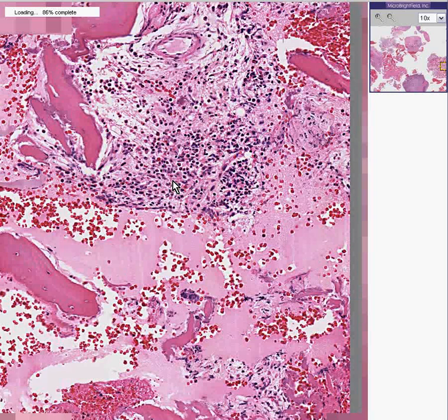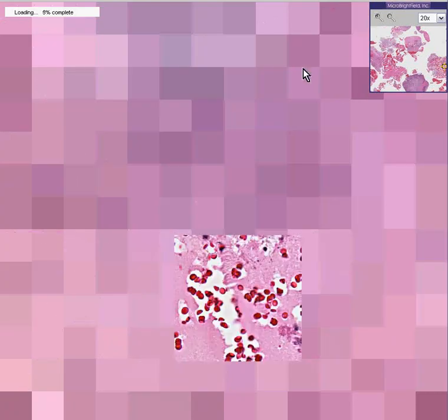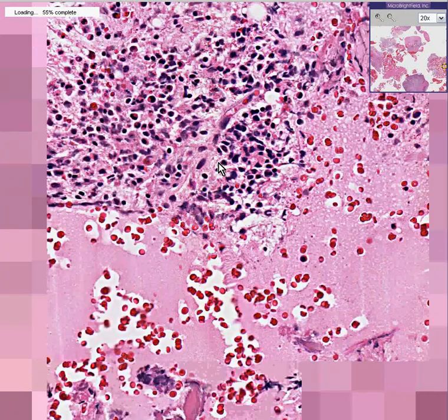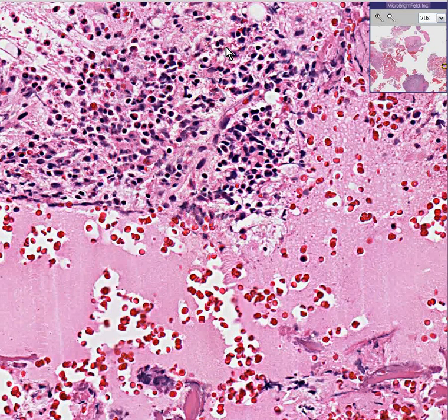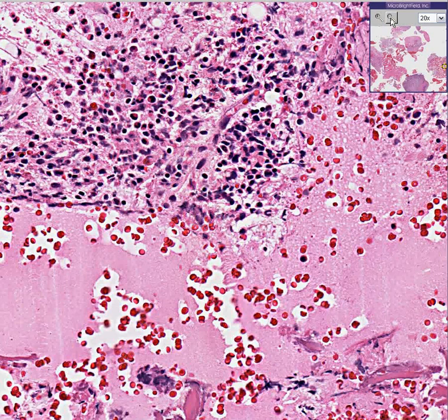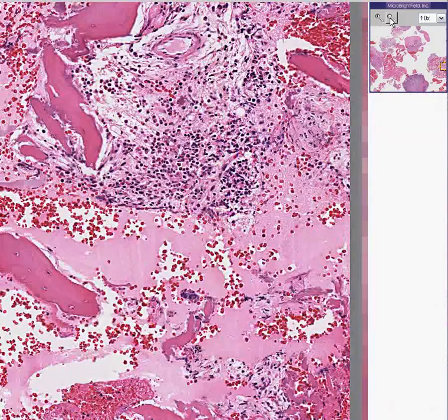In this case, I think they're chiefly lymphocytes, but if you look here, they're probably half lymphocytes and half neutrophils. So this is not entirely chronic inflammation — this is acute osteomyelitis.